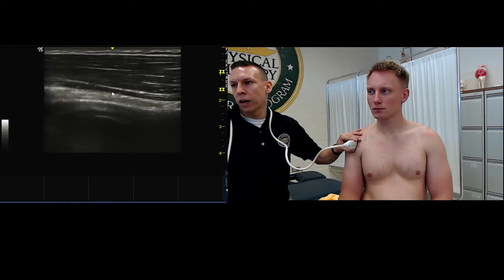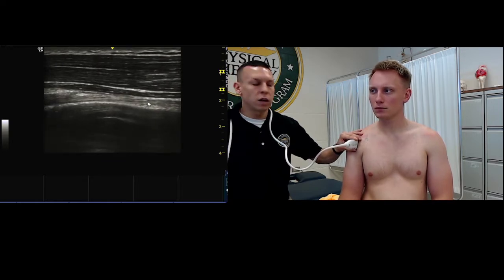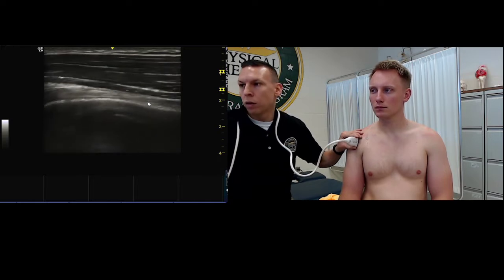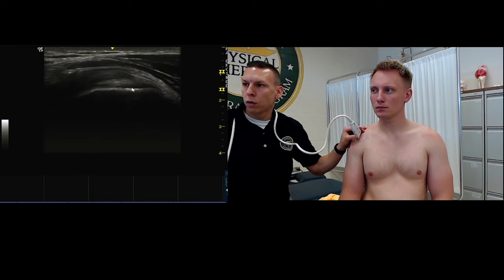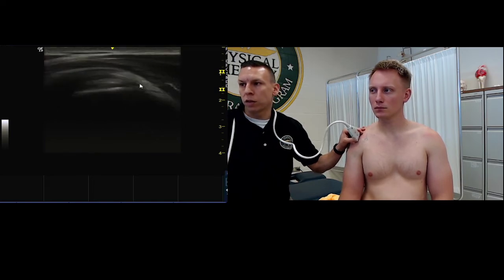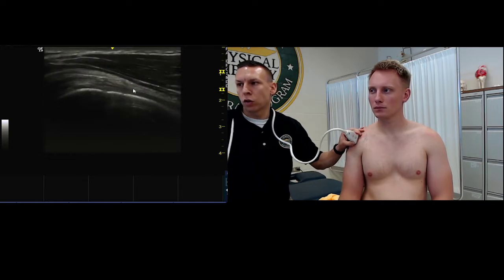And so we can look at it all the way up and down along that structure if you like, and you can come as far as you want superiorly, but it's going to become difficult to visualize as you move further up the shoulder.